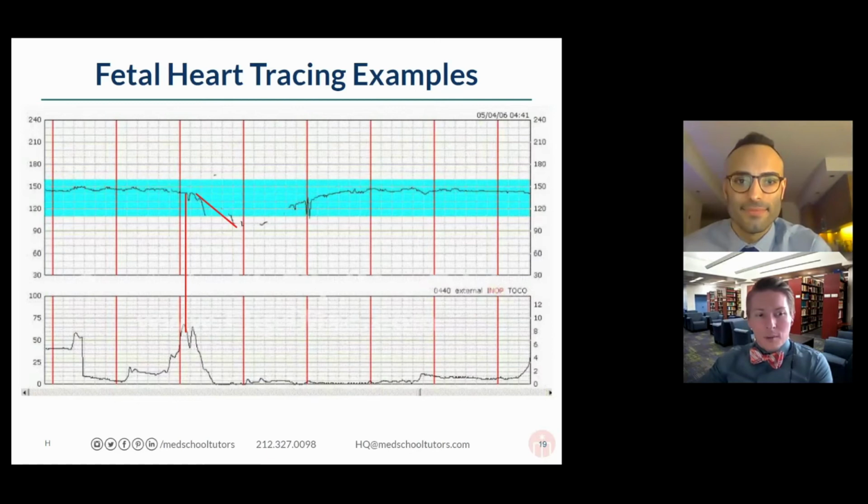If we were having a person coming in for routine third trimester screening, a woman comes into clinic, we do our non-stress test in order to evaluate whether or not she has a safe and healthy fetus, essentially. The reason we're doing that non-stress test is to evaluate whether or not we might need to emergently deliver that baby. We don't want to just guess at when we need to deliver a baby or guess at when the baby's in danger. And so the non-stress test is our first step.